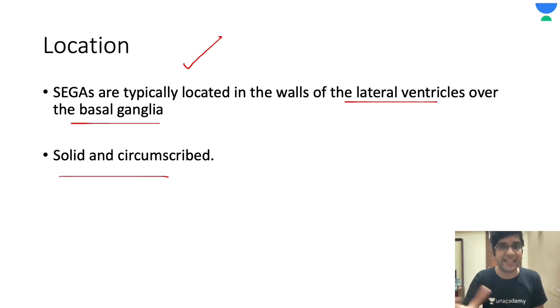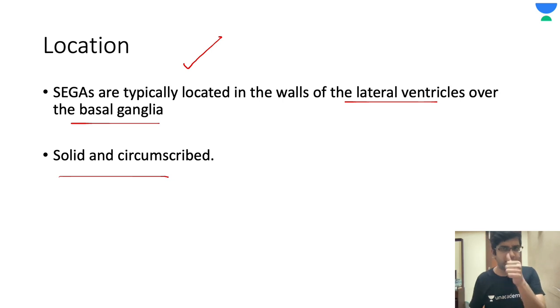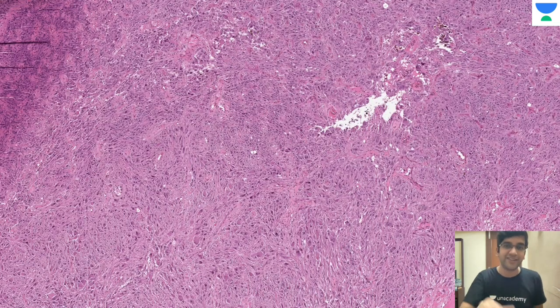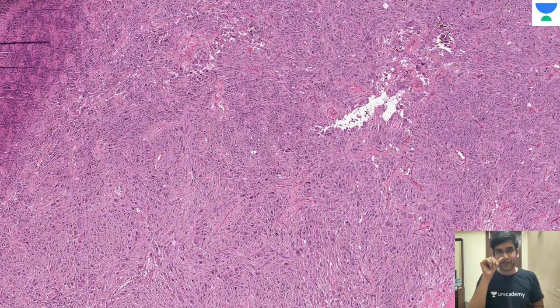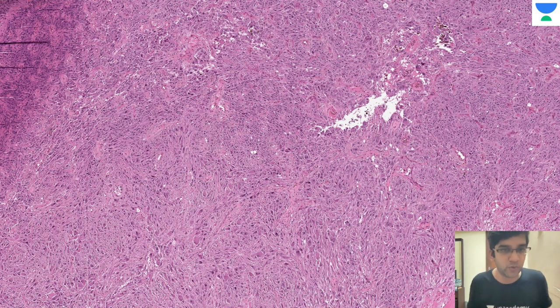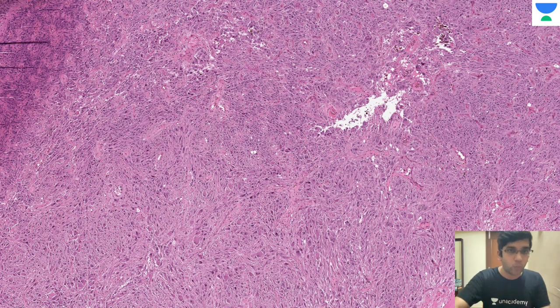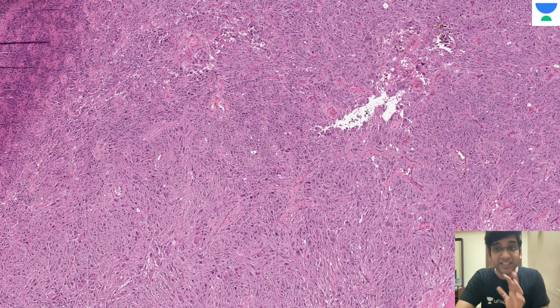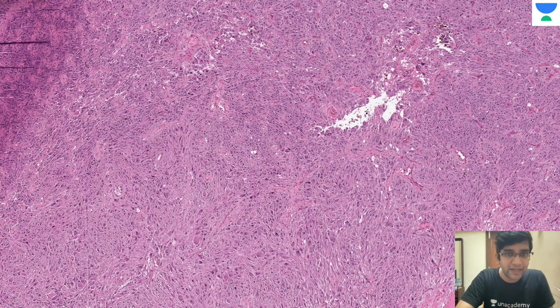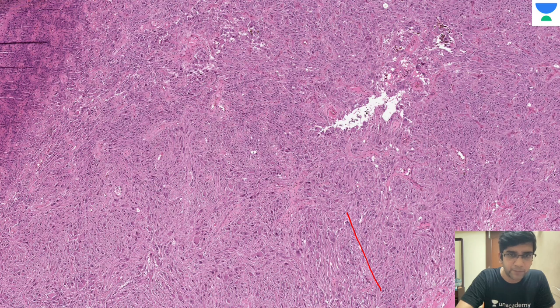Grossly, if I have an excision, they have a very solid and circumscribed appearance. Areas of hemorrhage can be there because they will have vascularity as well. Now looking at the microscopy — this is a very low-power image from our case. One thing you can see even in this low-power image is that cells are a bit elongated here — elongated in multiple areas.